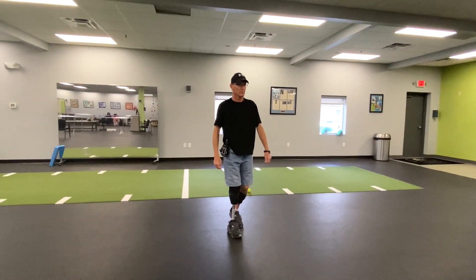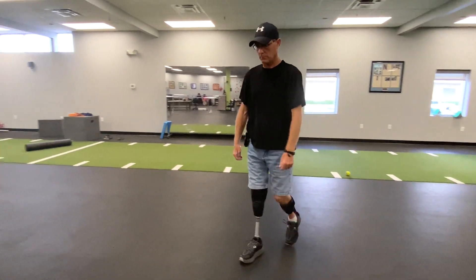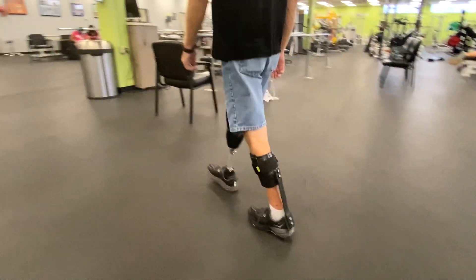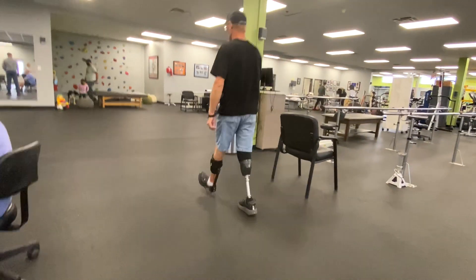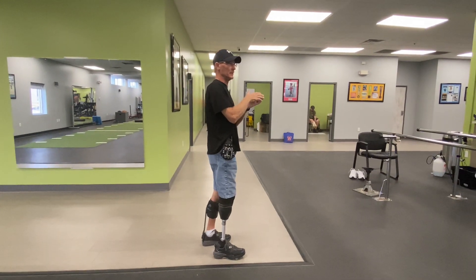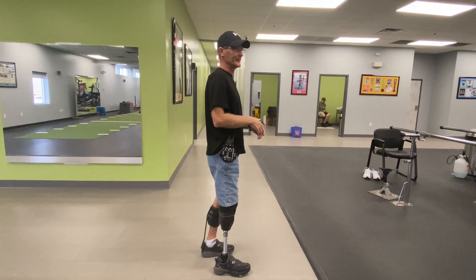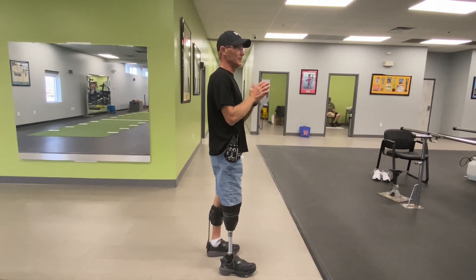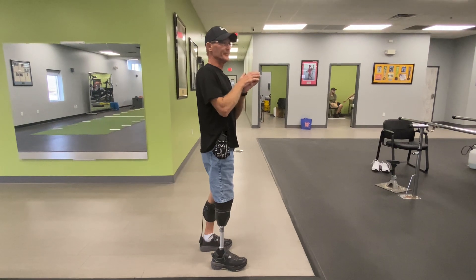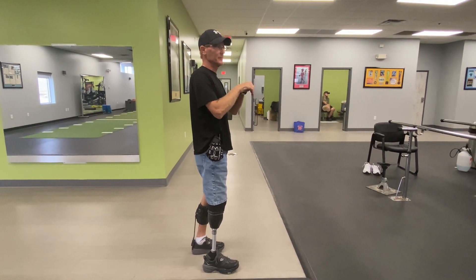It depends on how much it rolls. I can feel it wants to stop, and now I can feel the work — it feels like I want to respond and push those toes down. And then it responds.